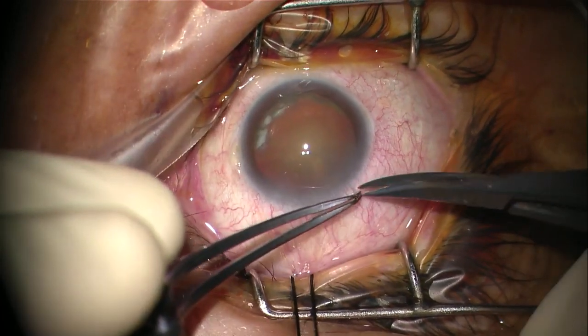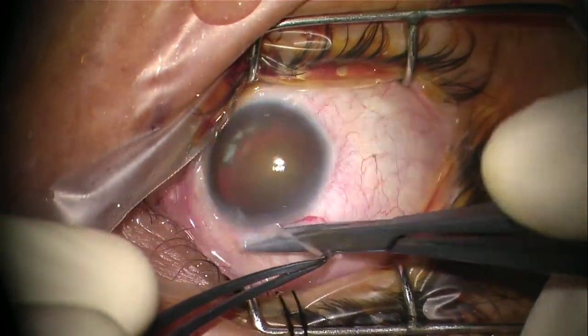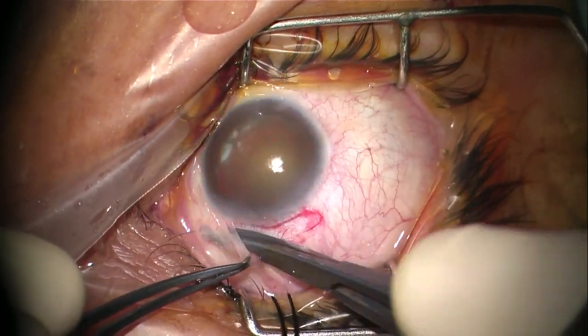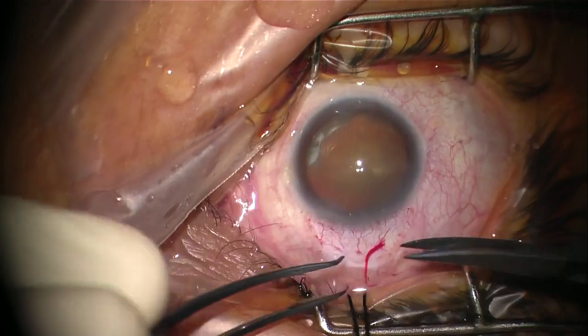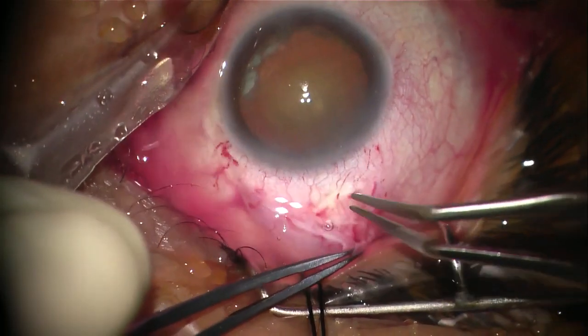Next we open a fornix-based conjunctival peritomy. It doesn't need to be a large one — we only need to expose 7-8mm of the sclera. Then gentle cautery for the scleral blood vessels.